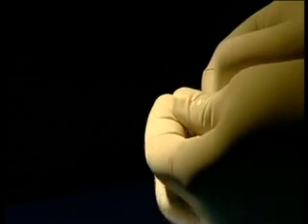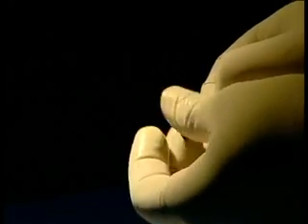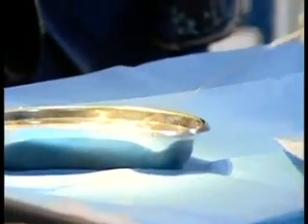This device also comes with its own delivery system. They have a special catheter as well as the wire. If you look at the wire for this device, it is very different from the wire for a PDA or an ASD. Can you show us the cable, please? It's very thin and it is extremely long. I think it is about 200 centimeters long. It's completely different from the usual ASD or VSD wire. It is very flexible. It can take any amount of tortuosity.